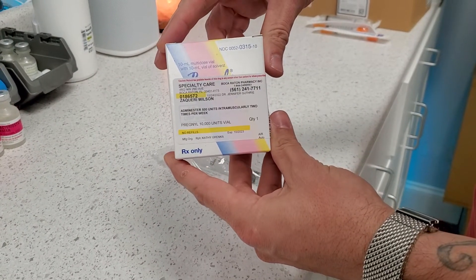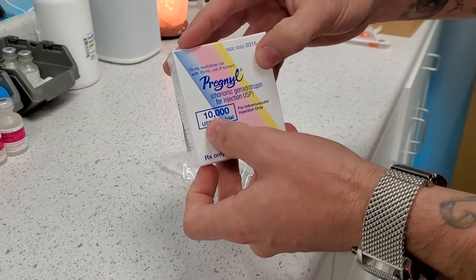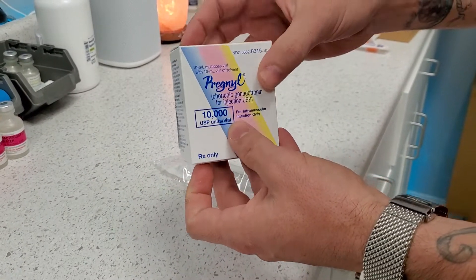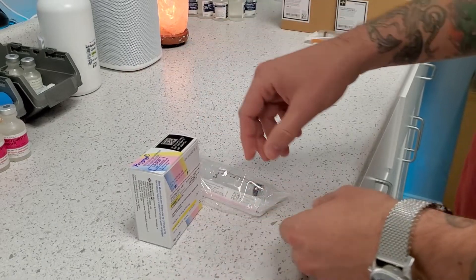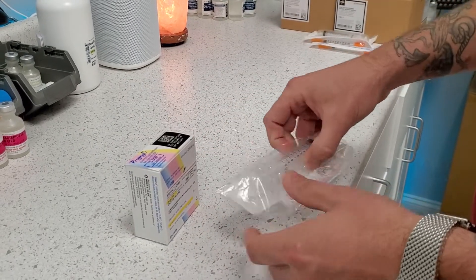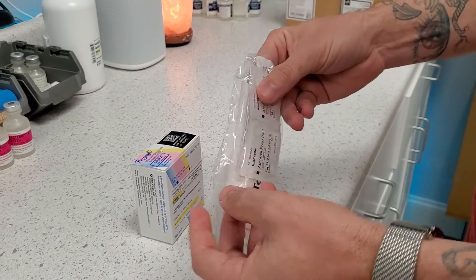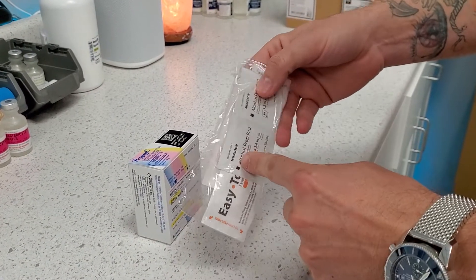We're going to be reconstituting Pregnal, or HCG. It comes as a 10,000 unit vial. Inside the box, you're going to have this little box of Pregnal, and then the pharmacy should supply you with a 10 milliliter syringe, and then there's also a little needle in there, and some alcohol pads.